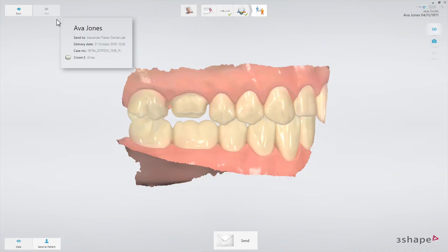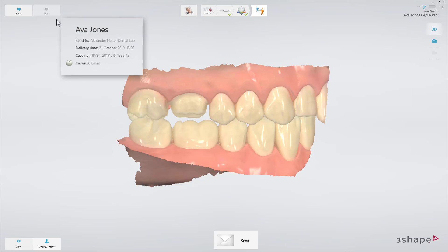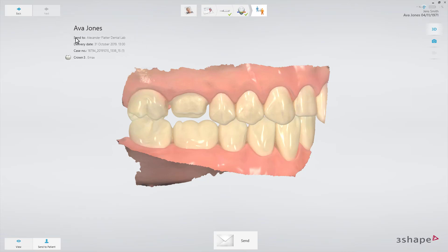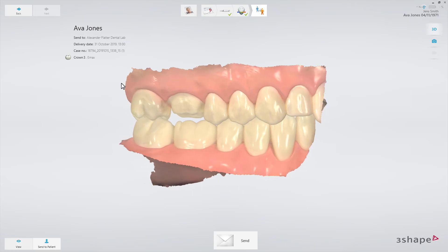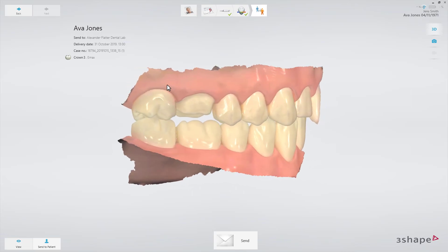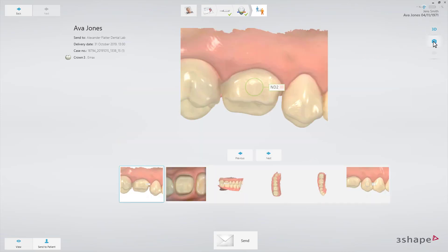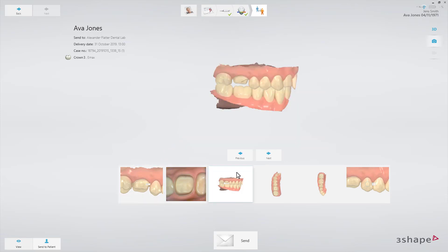On the Send page, the order is ready to be sent to the lab or manufacturer. You'll see a summary of the order on the screen. The 3D scan is visible on the screen, and if necessary, you can revisit attachments like HD photos, screenshots of scans, and shade measurement or recorded videos.